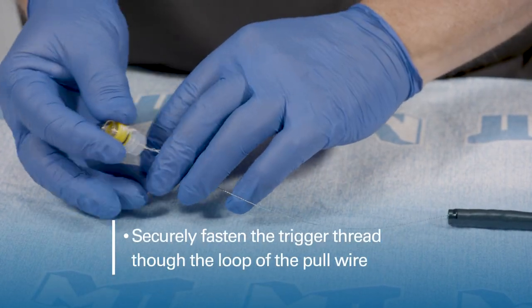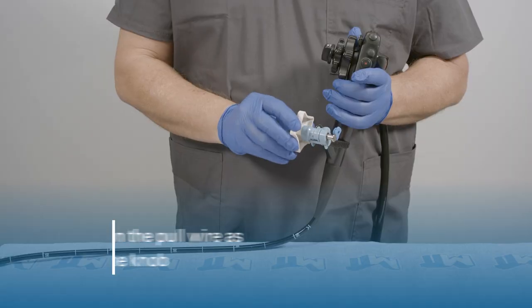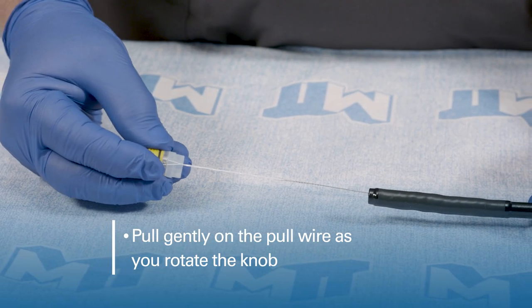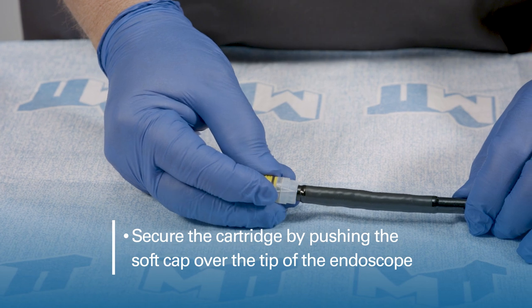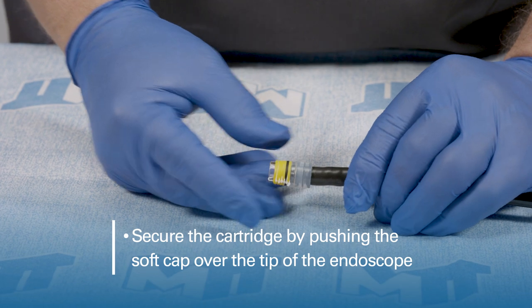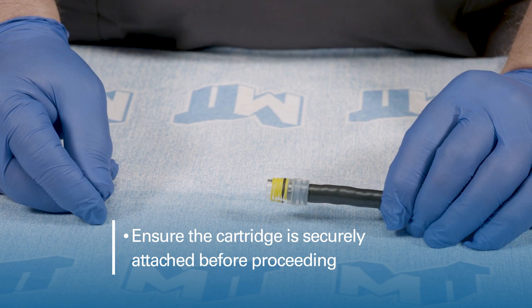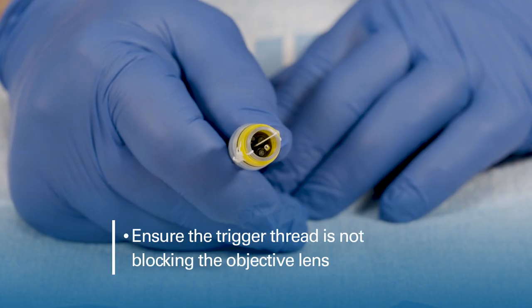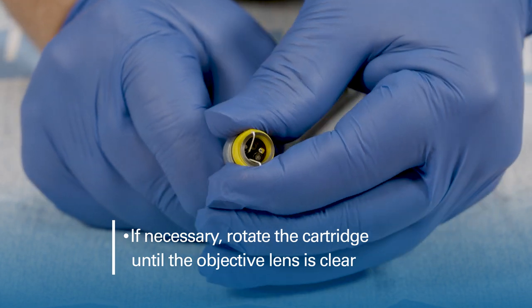Ensure that the trigger thread is securely attached to the pull wire. Continue winding until the slack has been removed. Secure the ligator cartridge onto the distal end of the endoscope by pushing the soft cap over the tip of the endoscope. Ensure the cartridge is securely attached to the endoscope before proceeding. Inspect the end of the scope to ensure that the trigger thread is not blocking the objective lens. If necessary, rotate the cartridge until the objective lens is clear.